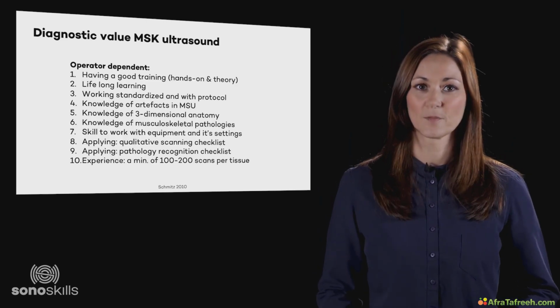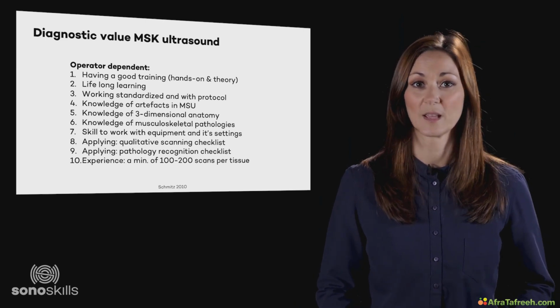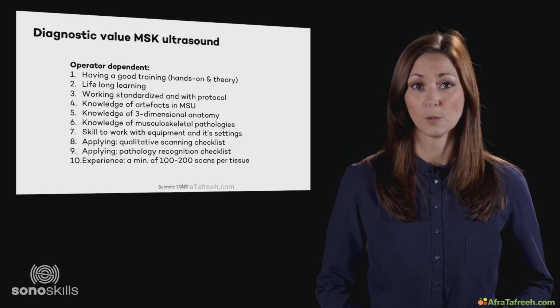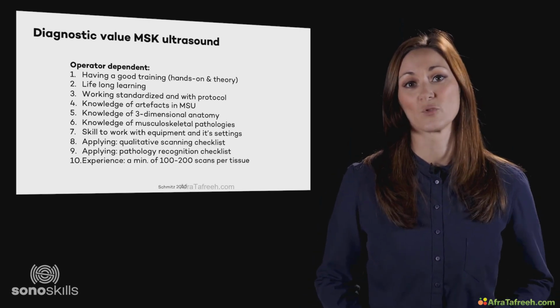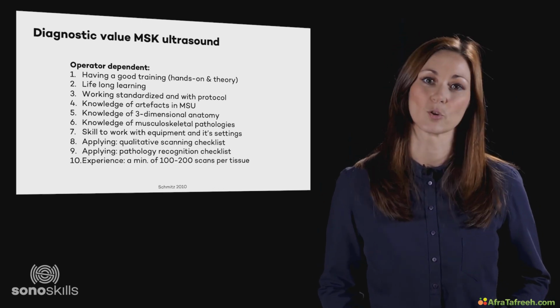These operator-dependent factors are numerous. Firstly, you need good education, which contains blended learning, a mix of hands-on practice and theory. More hands-on practice is always better. This is the reason we use an e-learning platform to make sure that you study the theory at home and you have more hands-on hours when you visit the course.